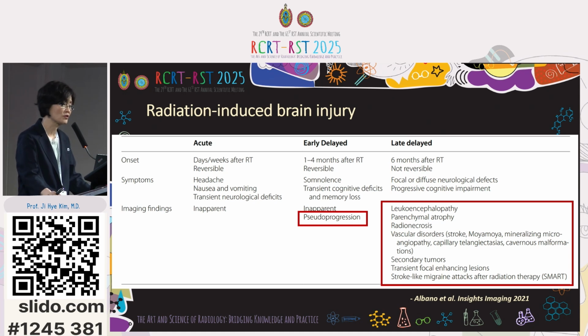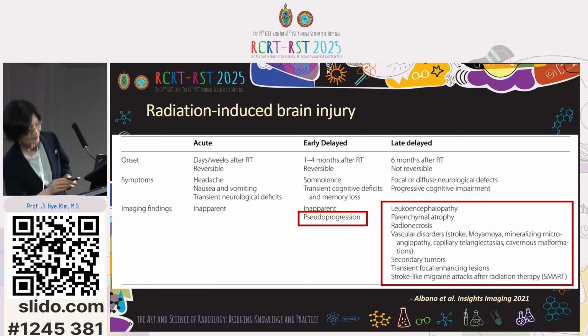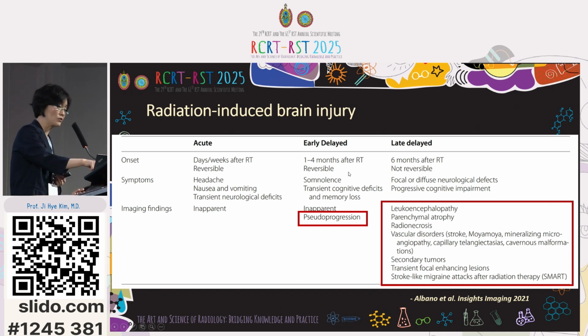RT-induced brain injury can be classified into, excuse me, can you enlarge the images? Sorry, I cannot see the images, so it's too small. More, please. Thank you.